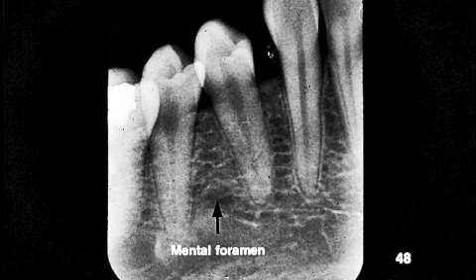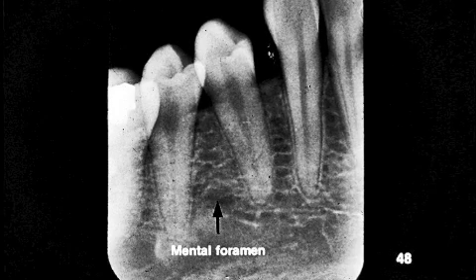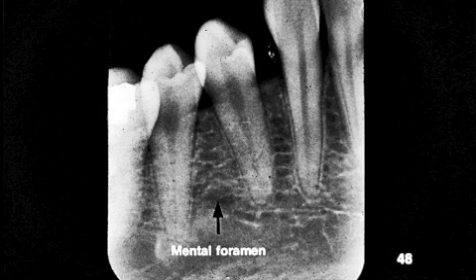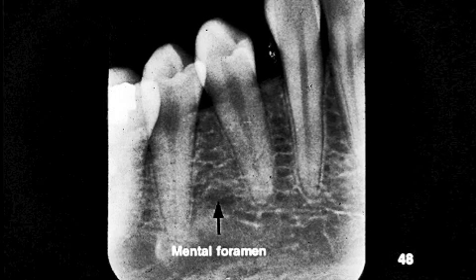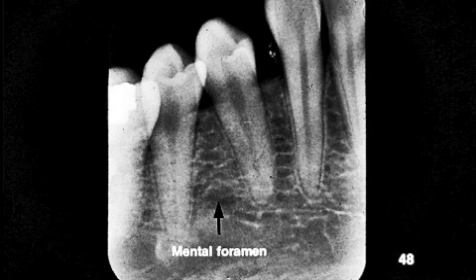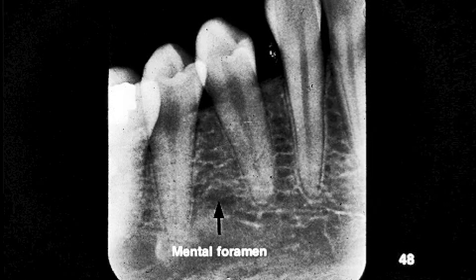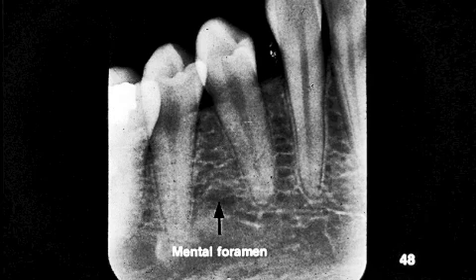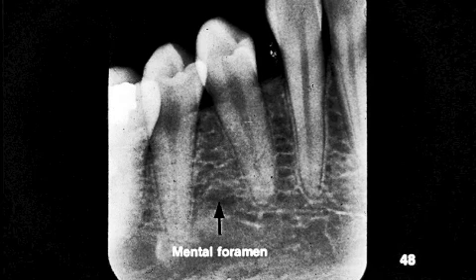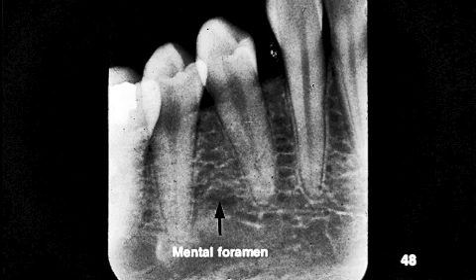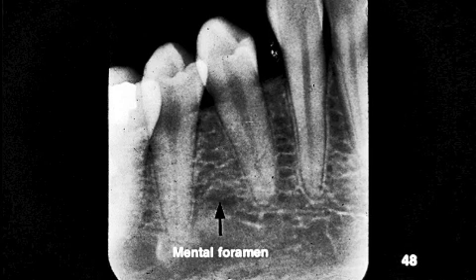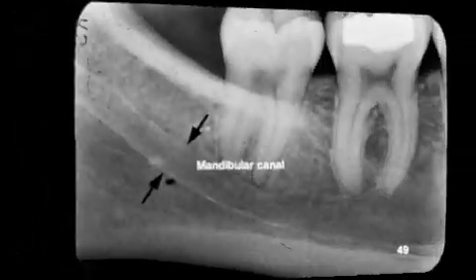Between the premolars is the radiolucent mental foramen. Sometimes it can even appear at the apex of a tooth and look like an abscess. To differentiate it from an abscess, another view would be taken, and if the radiolucency moves, it is anatomy. If it's fixed, it's pathology.